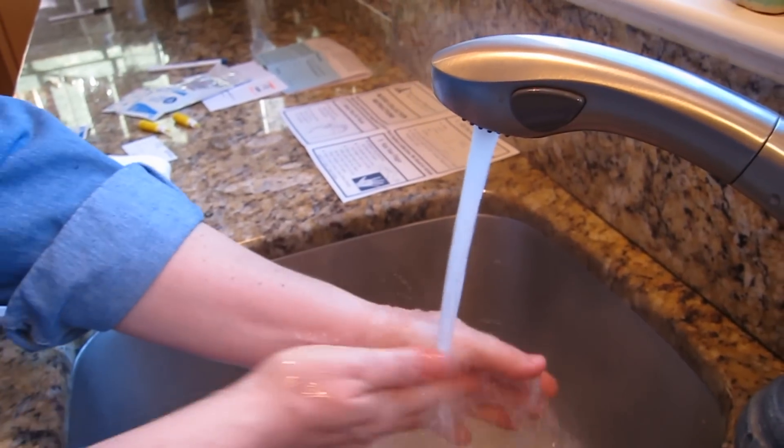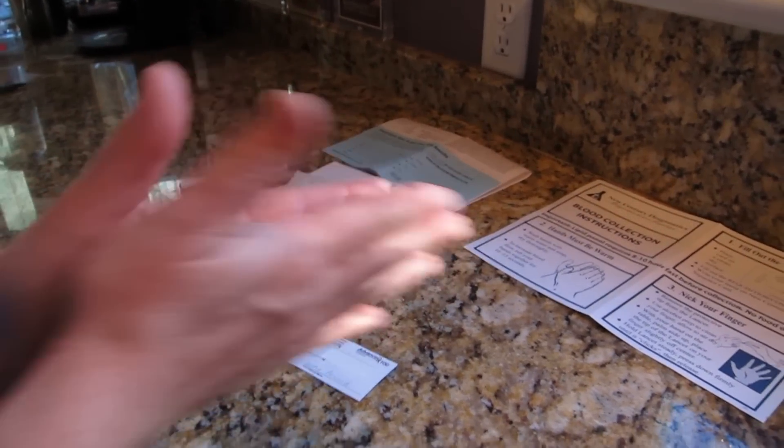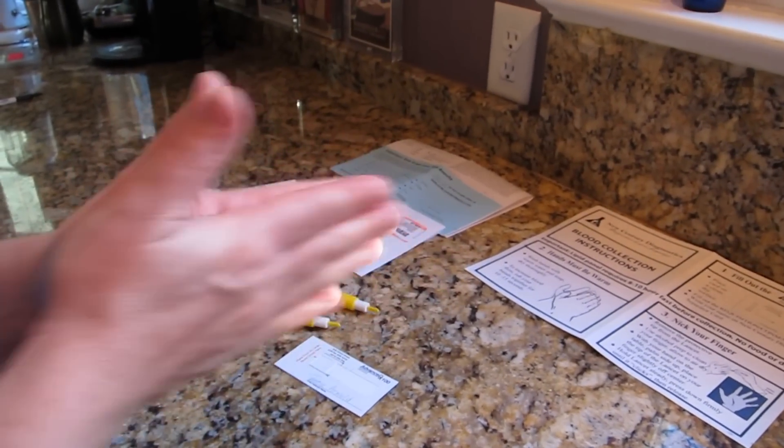Wash your hands with warm water and soap and dry them thoroughly. It helps to increase blood flow to rub your hands together for 10 or 15 seconds. It also helps to stand while doing this test.